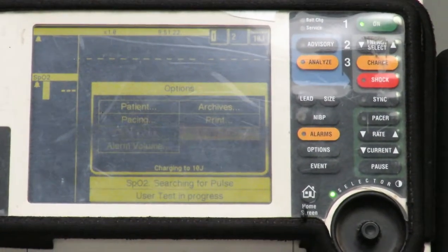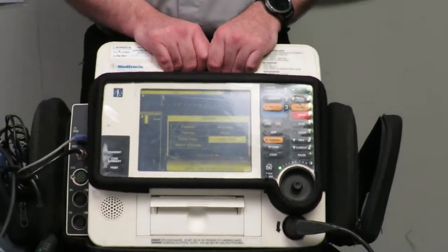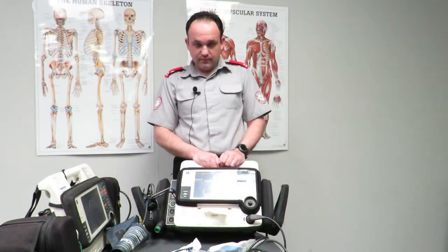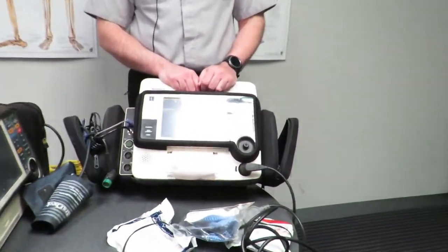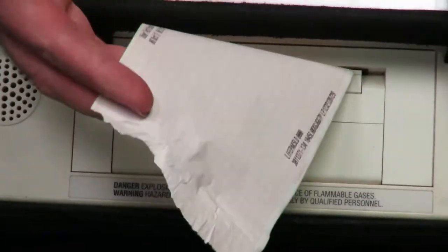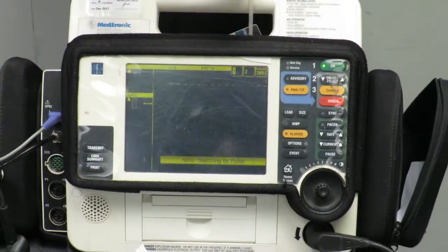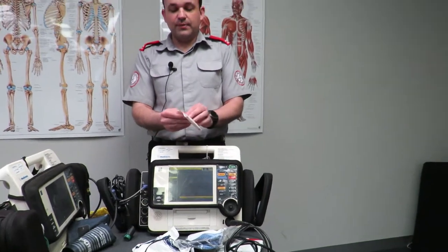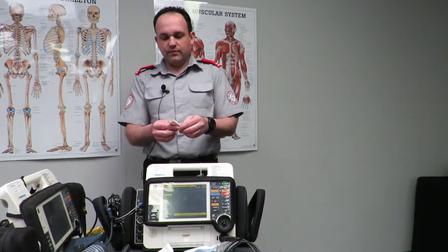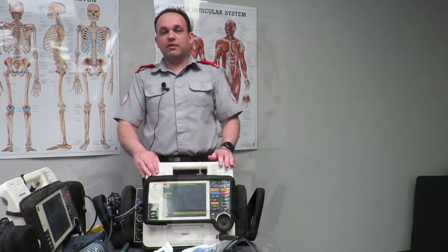This will now start a self-test of the unit, which should take approximately 30 seconds. Once done, a strip of paper will print out. You tear that off, sign and initial it — it says 'user test passed.' Fold it up and slip it in the top of the case so we can easily reference it later.